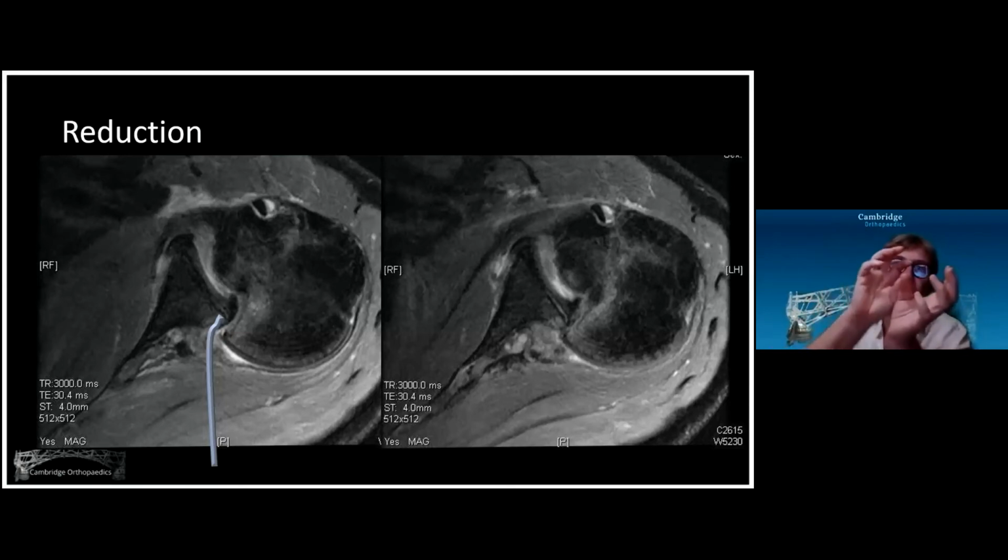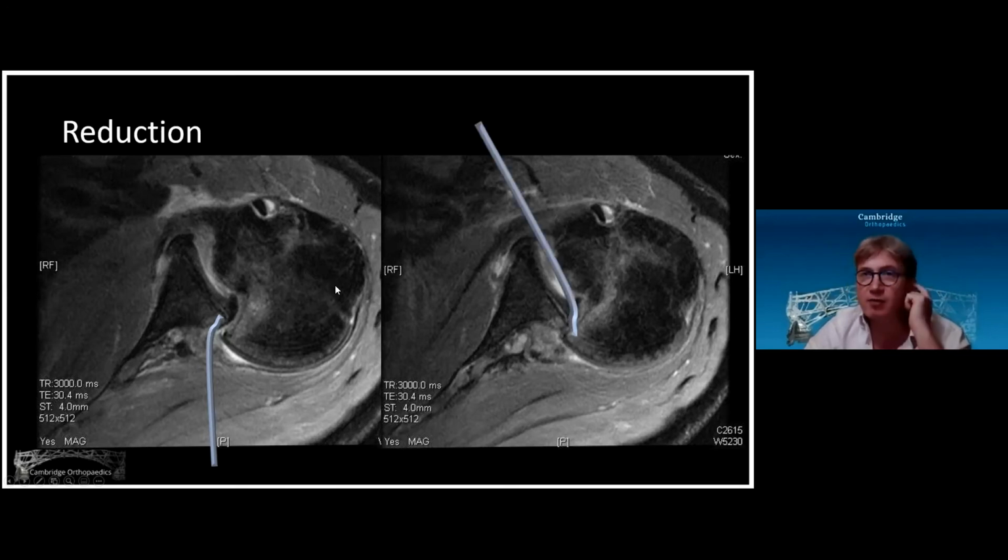And if that head fragment is attached to the shaft, you can then, once you've disengaged it, externally rotate the arm and reduce the head. It's often much easier to do the rest of the approach once the head is reduced, because the anatomy returns to near normal. If you can't get it from the back, then you can still reduce it percutaneously from the front using that rotator interval. Open up the rotator interval, separate subscapularis and supraspinatus. You can see where the glenoid is. You can see where the head is in the back, and put a ring handle spike and disengage it from the back.